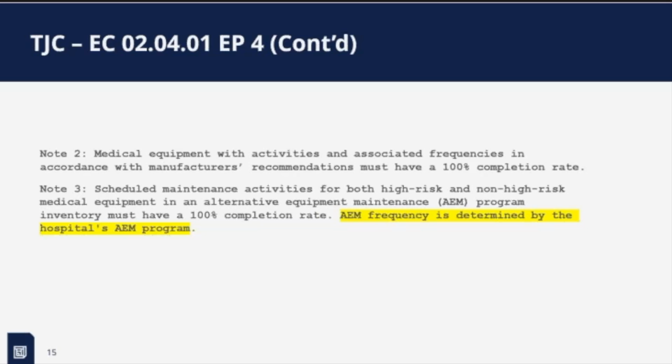I did another talk, I think at the HTM mixer in Denver, and then also at the MD Expo earlier this year, on unable to locate assets. And if you're unable to locate, how do you maintain your 100% rate? Those should be online somewhere, but there are some tips and tricks there on how you get to that 100% with your unable to locate strategy. That's a different type of strategy for percentage reporting. It's all about maintaining statuses and documenting everything you did to find that equipment.